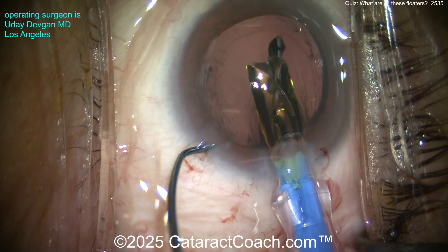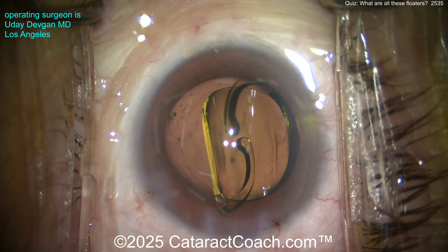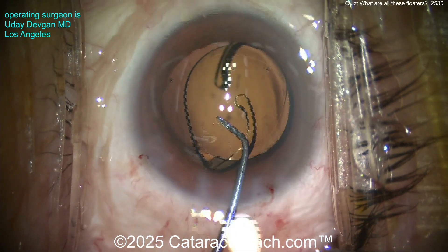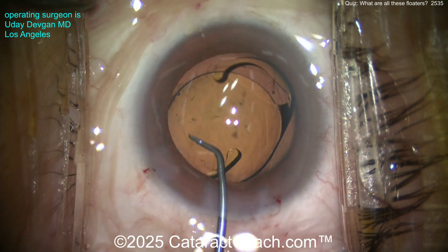Here comes the lens — a single-piece acrylic lens going right into the capsular bag. This is a one-handed injector, which is why I can use my left hand through the paracentesis to hook and fixate the eye. Now let's deliver the lens, get it into the capsular bag, and we'll finish up the case.